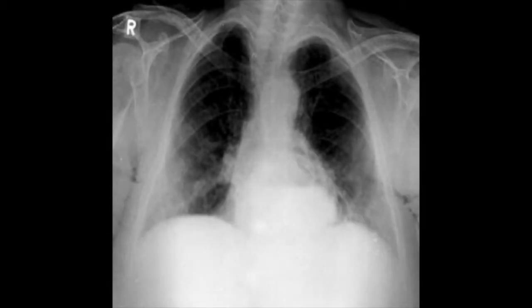We have here a chest X-ray PA view of an elderly gentleman who is due for surgery the next day. Before we comment on this X-ray, let's take a few seconds to identify where the abnormality is. What we have here is a very clearly defined air-fluid level in the retrocardiac region of this chest X-ray.